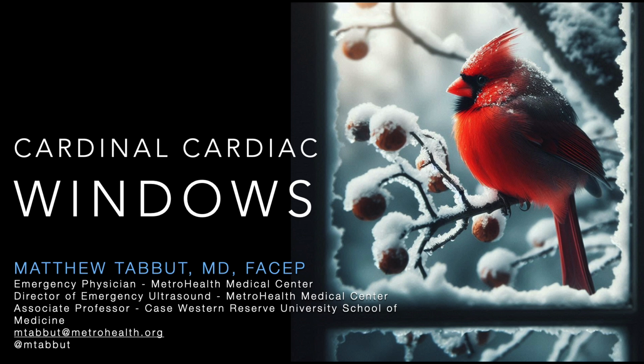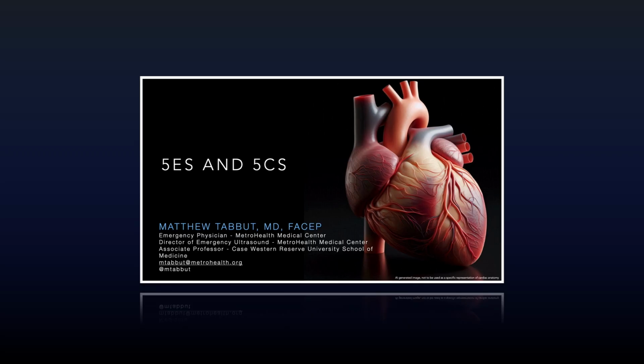And we talked about, like I said, the 5 E's, the 5 C's. We talked about the entrance. We talked about the exit. So we talked about the IVC and the aorta. Those are the last two. We talked about the effusions, whether or not there's fluid around the heart, how well it is squeezing with an ejection fraction. And we talked about equality, so right side versus left side, and is there evidence of right heart failure, right heart strain, and things like that.